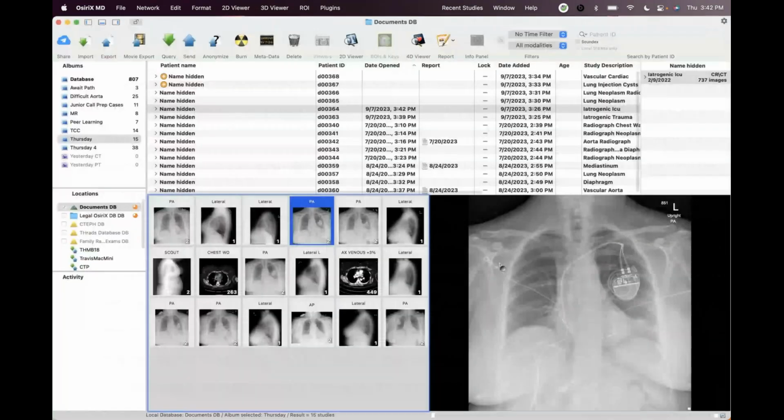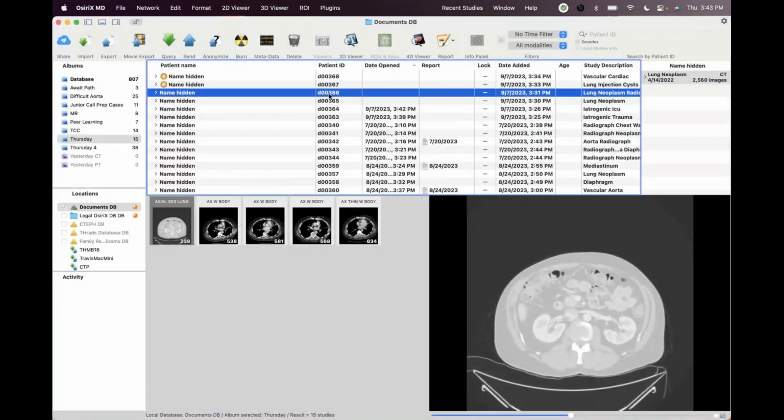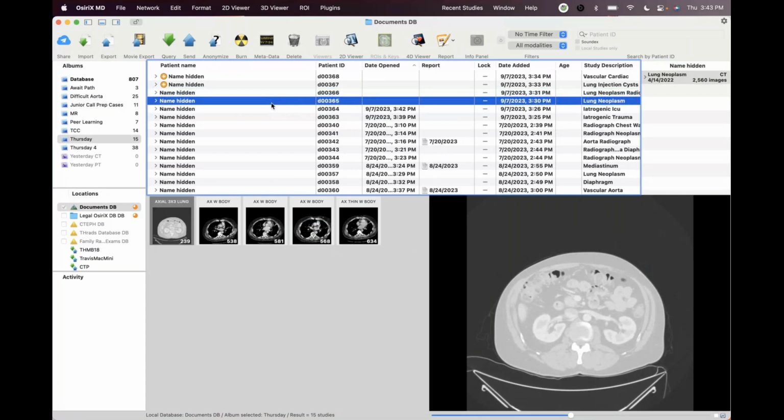Are they meant to be just put in place to soak up some blood, as a hemostatic, and then they leave it there for 20 minutes and then take it out and continue? Correct. It's a hemostatic agent, right? It's obviously not meant to be left behind permanently. I don't know the exact amount of time, but it's also been referred to as trauma gauze, I think, or stuff that gets used on the battlefield or on the scene.